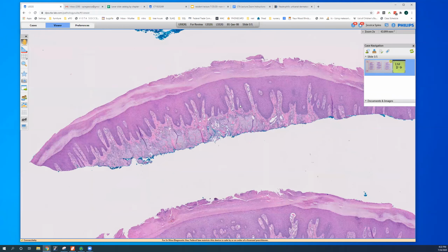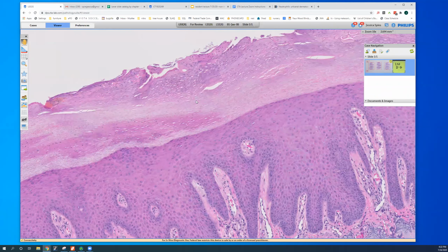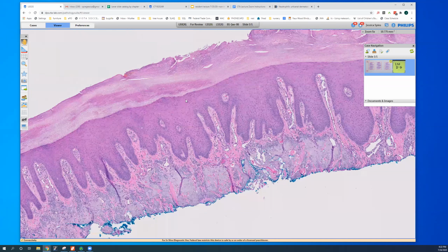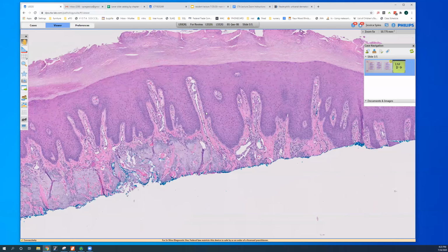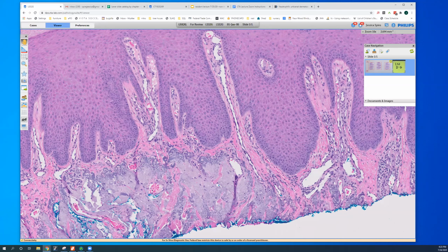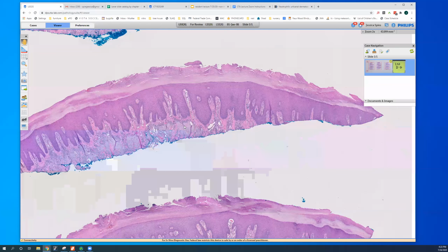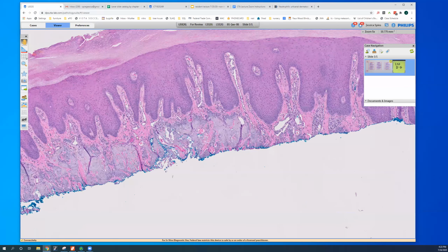this histology is what Ackerman called the hairy palm sign, and that is, this is what looks like acral skin, but it's not. So you get this massive hyperkeratosis, mostly made of compact orthokeratosis. We get some hypergranulosis, this marked epidermal acanthosis, you might even call it psoriasiform. And then you get these very characteristic vertically oriented vessels in the dermis, and a little bit of fibrotic stroma. And all this gray stuff is solar elastosis. This is on really badly sun-damaged skin. And you can see this fibrosis is kind of pushing it down.